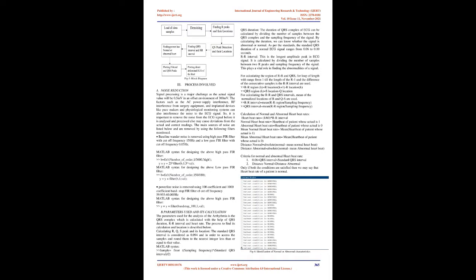The typical ECG signal consists of P, QRS, T, U components. The QRS complex plays a vital role in identifying the problems that occur with the functioning of the heart. If any problems are associated with the heart, then the QRS complex lengthens or widens or becomes shorter. The abnormalities in the rhythm are mainly observed with the help of parameters QRS duration, RR interval, and heartbeat rate.